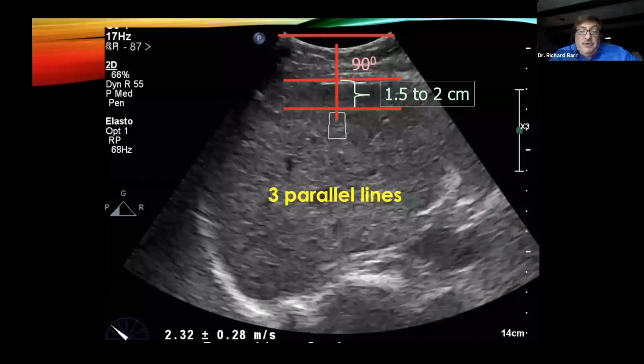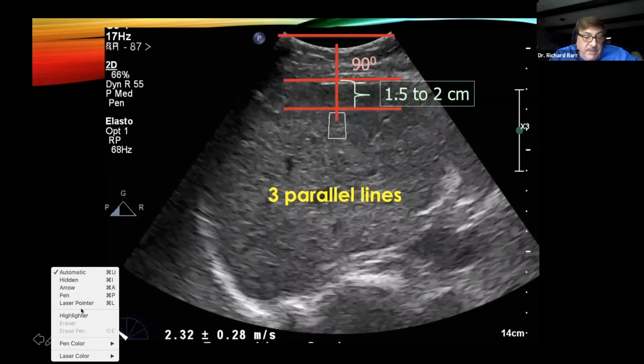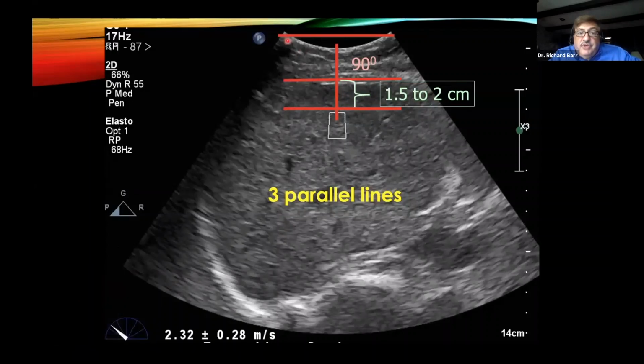So this is our protocol. You can see, and I think I can do a little laser pen here, that here is our transducer. We're going to have the liver capsule parallel to the transducer. We don't want the liver capsule angled like this. And usually when you find your window, it's just a few tiny motions of your wrist to get the capsule nice and perpendicular.